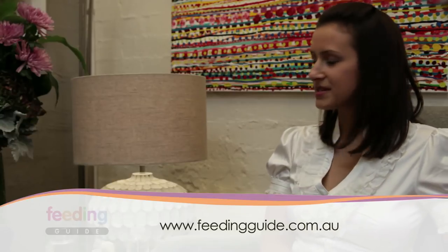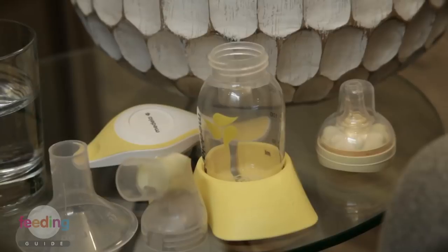Hi, my name is Andrea and today I'm presenting a how-to video on behalf of the Feeding Guide on how to express breast milk using a manual pump. Today I'll be using the Harmony pump by Medela and I'll start by showing you how to assemble this pump.